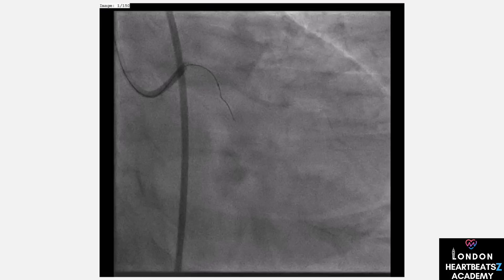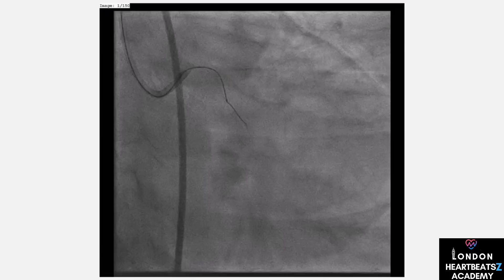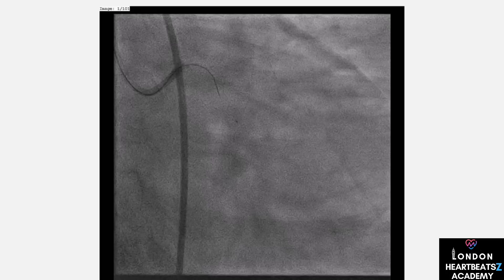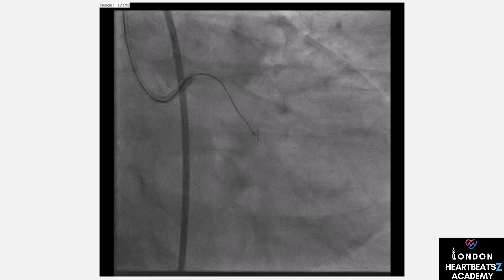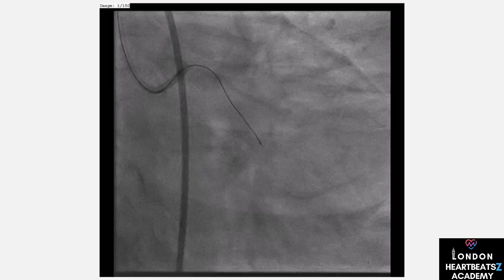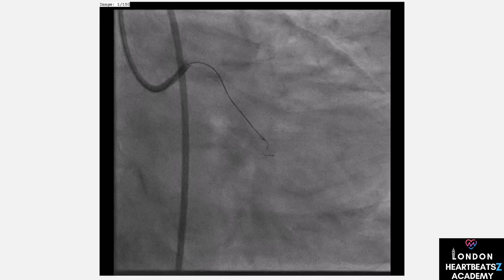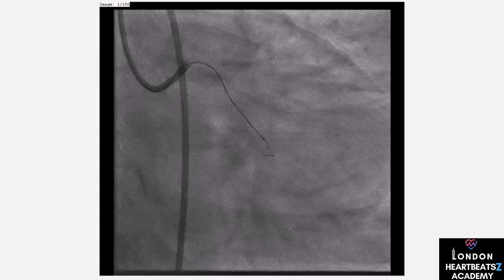Let me share some cases to illustrate these techniques. In Case 1, a 52-year-old male had a CTO in his coronary artery for a year. We used micro-channel probing with the Fielder XDR wire, relying on visual cues to confirm the true lumen position. In Case 2, we used the Gaia wire for redirection, tracking through loose tissue and using visual cues to adjust our approach.